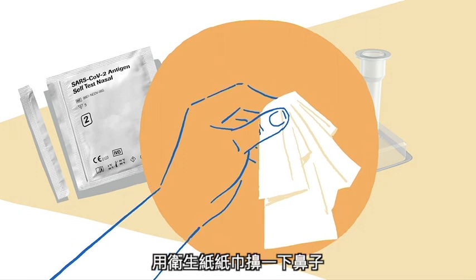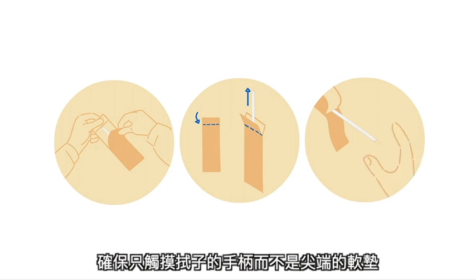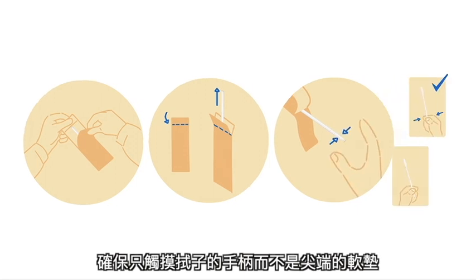Blow your nose once using a tissue. Remove the swab from the packaging. Ensure that you only touch the handle of the swab and not the soft pad at the tip.